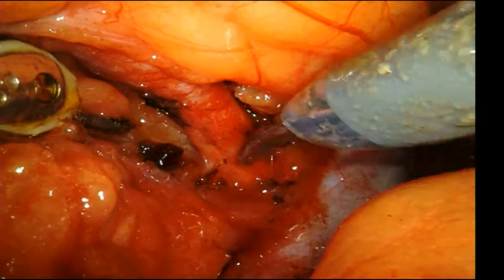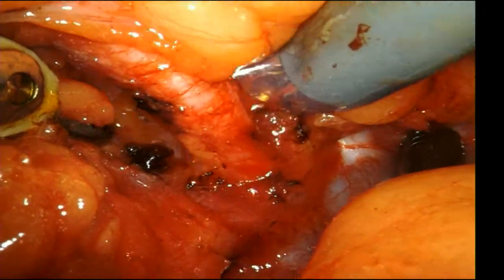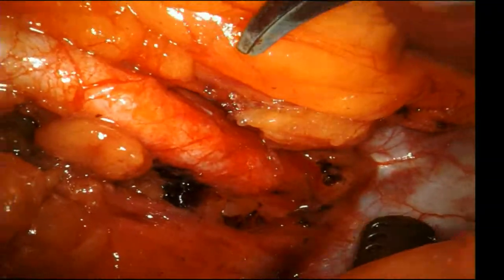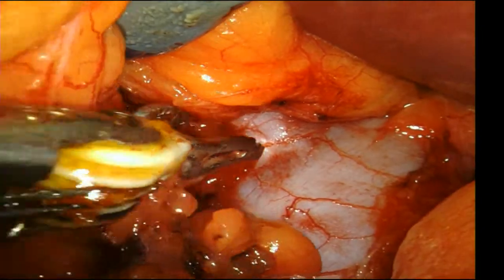So this is not what I expected. From the scan, it looked like it branched into 3 different branches behind the cava. I'm not sure if this is what we're going to be clamping here, but we have an easy way that we can test it in a moment.